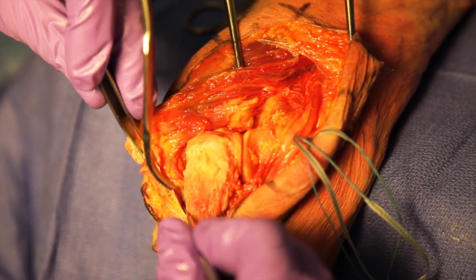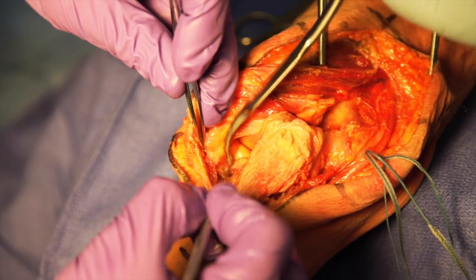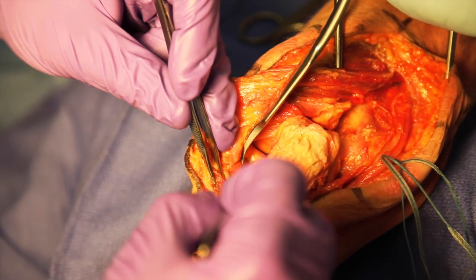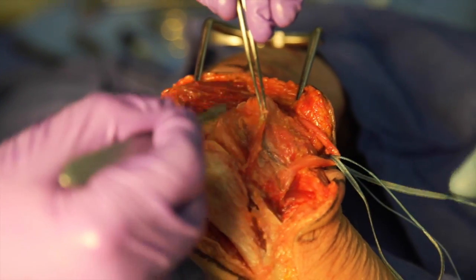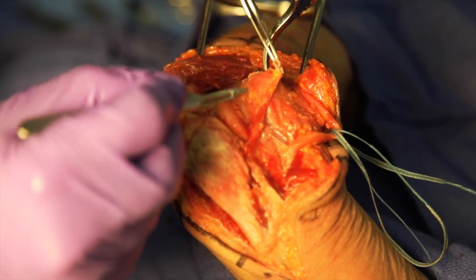Once this flap has been raised, you should have complete visualization of the olecranon and proximal ulna. The remnants of the triceps insertion and posterior capsule are then elevated off the distal humerus.